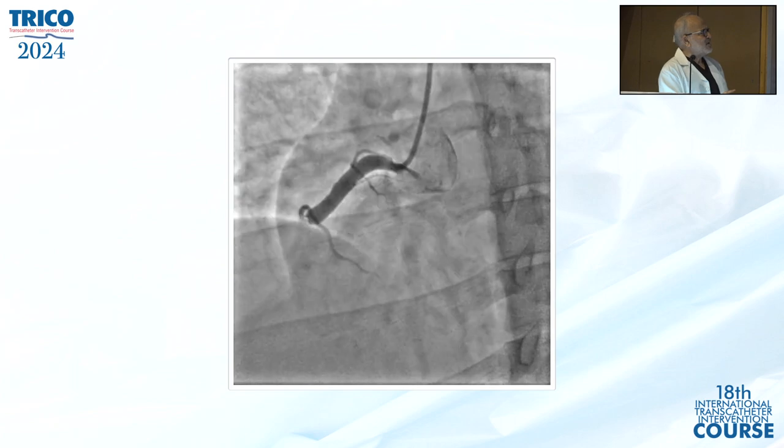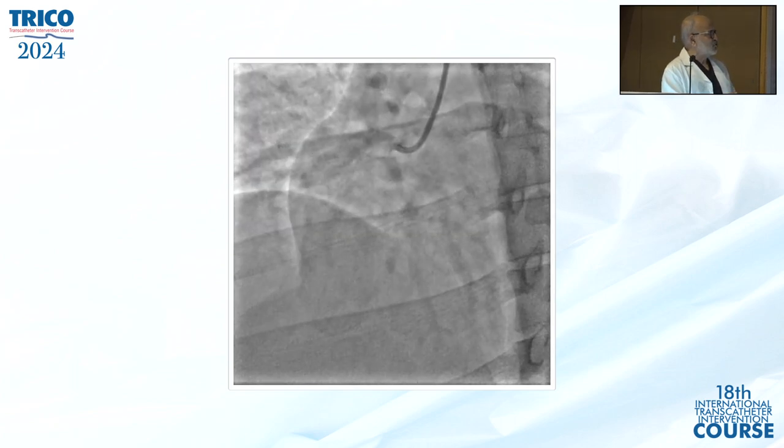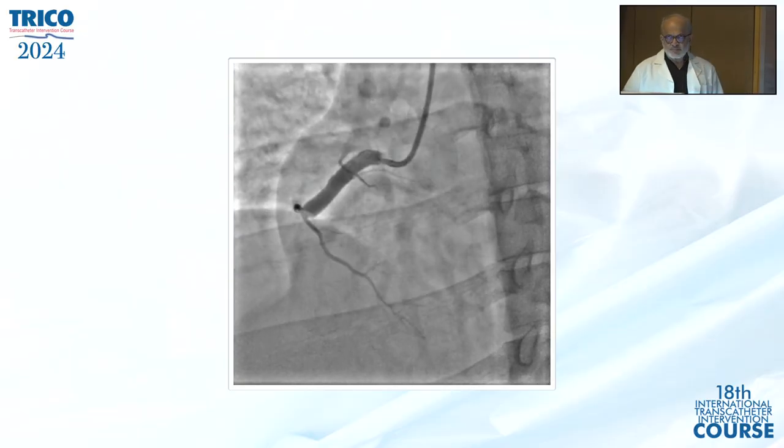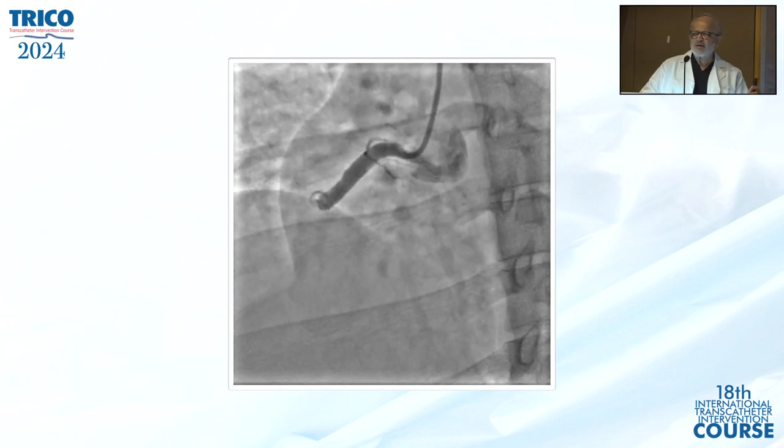What is your approach in this case? This is the whole artery. It is almost a 6-7 millimeter artery which is completely filled with thrombus. This case was done maybe 3 weeks ago in my lab. What do you think should be the approach?